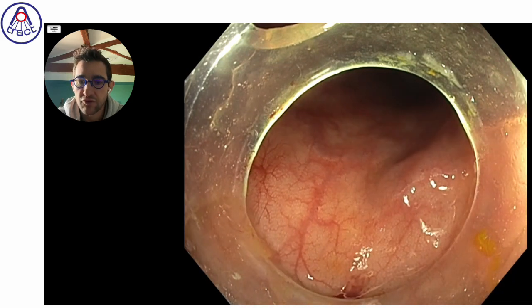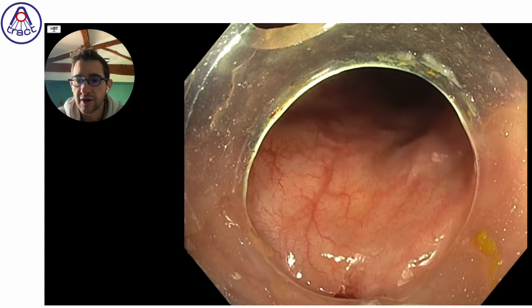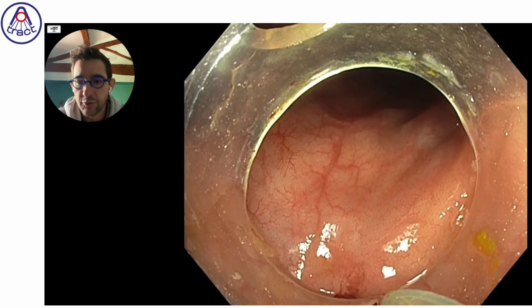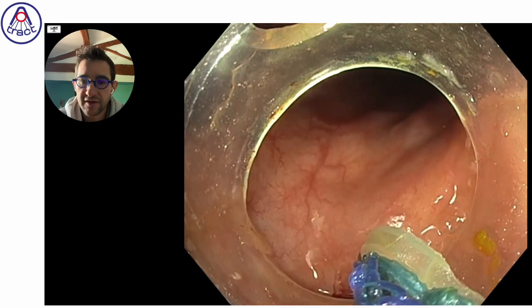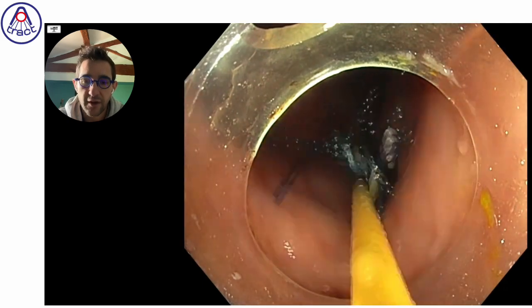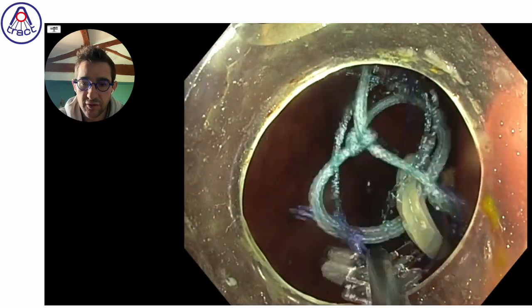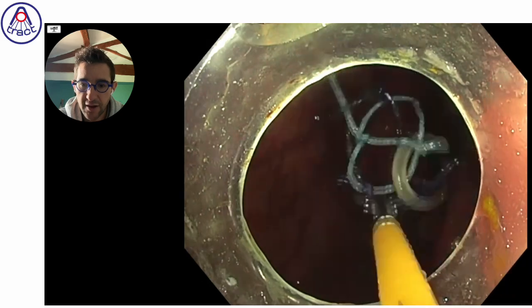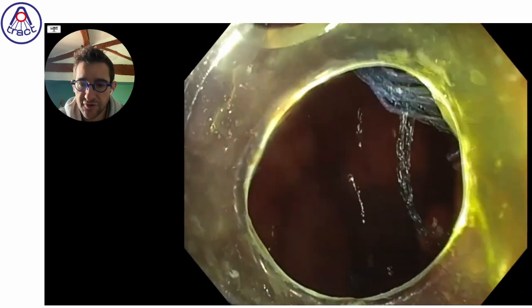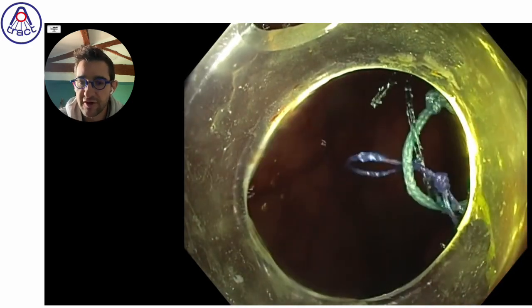With the small pediatric forceps, which usually is a foreign body forceps but used for the transnasal scope, that offers the possibility to insert the traction device through a 3.2 millimeter channel quite easily. So yes, you're right, it's not so easy to understand at the beginning, but really once you get used to the color and different loops, it is not so difficult to set up.